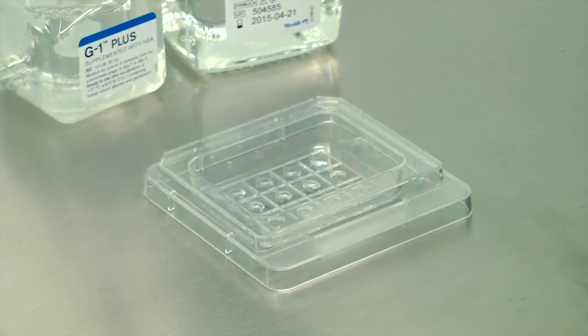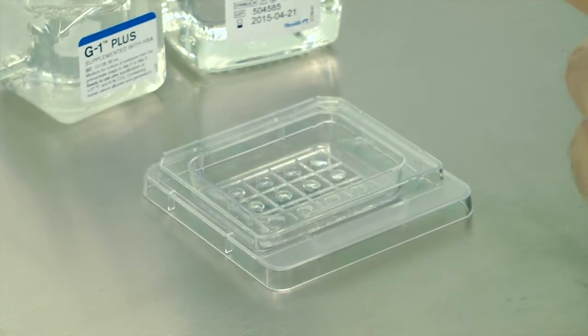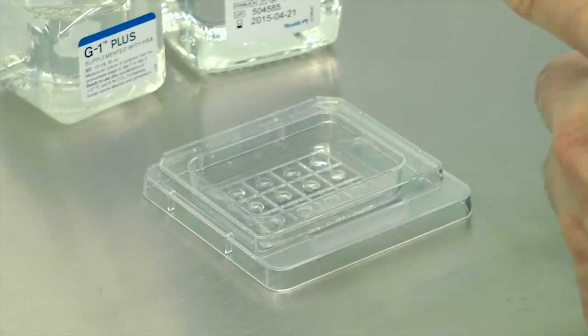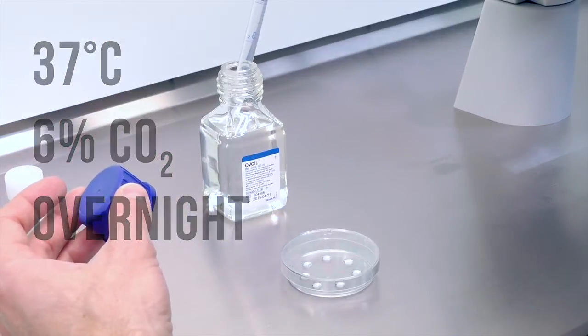Alternatively, if you use the micro droplet dish from Vitrolife, use 25 microliter droplets for the culture of one embryo per droplet. Cover these droplets with oil and equilibrate overnight at 6% CO2 and 37 degrees Celsius.